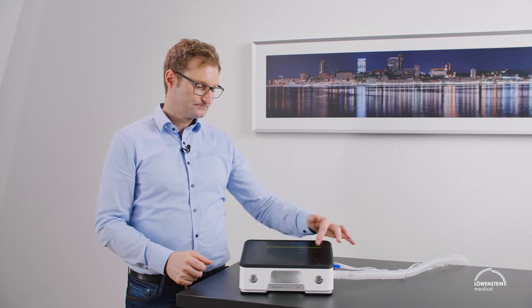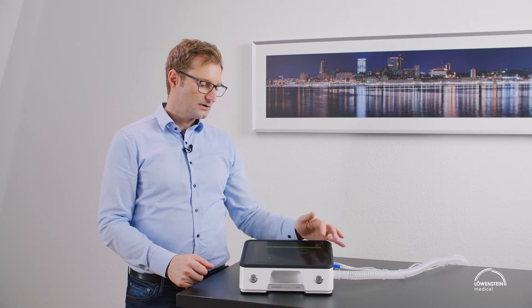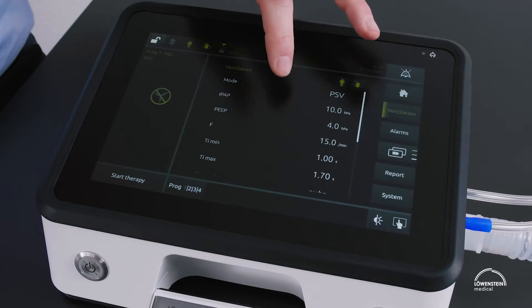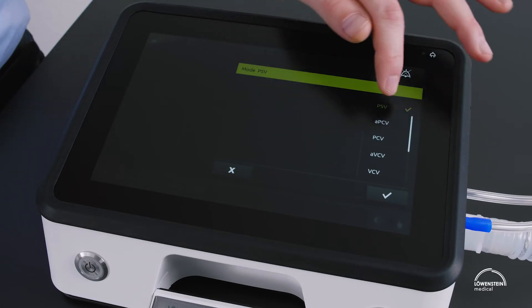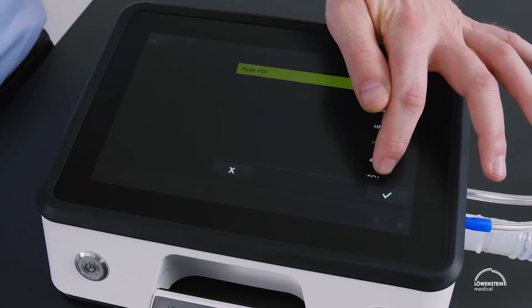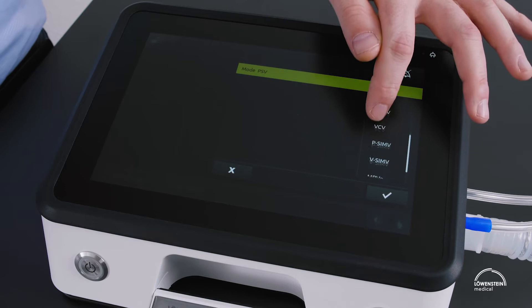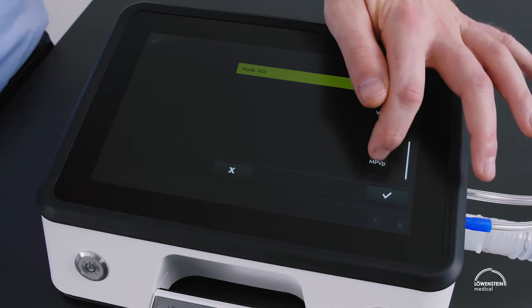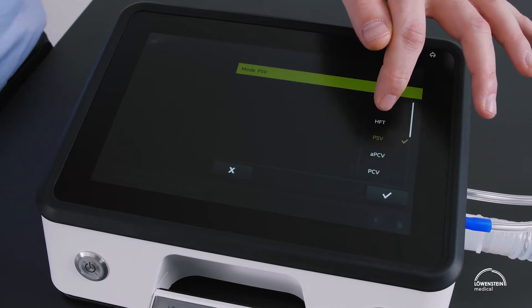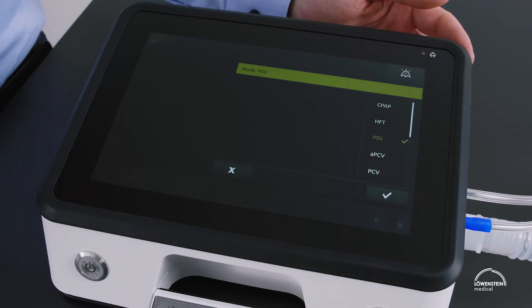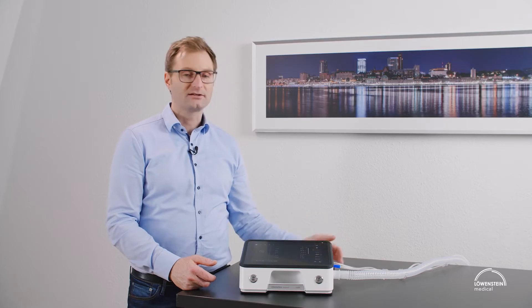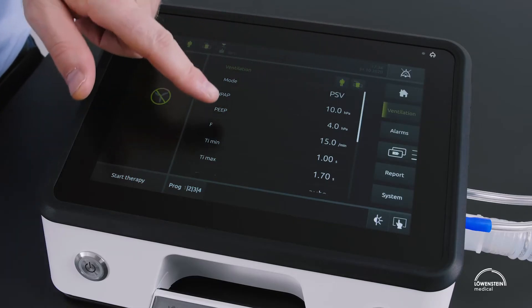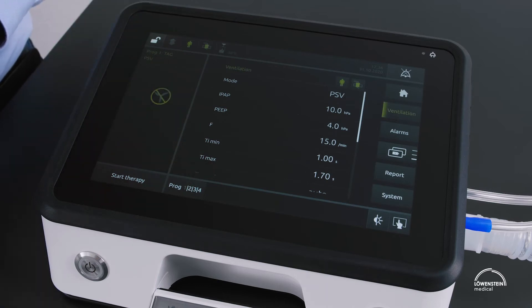Now we can go into the actual ventilation settings, beginning with the mode. On the right we have a list of all available modes for that circuit system and a dial to scroll up and down. I selected PSV mode, and now all settings available for PSV mode can be set.